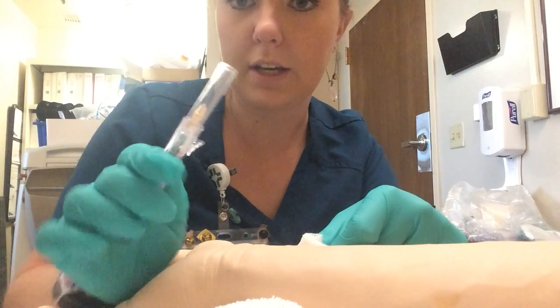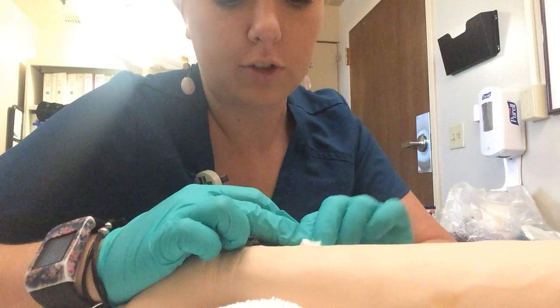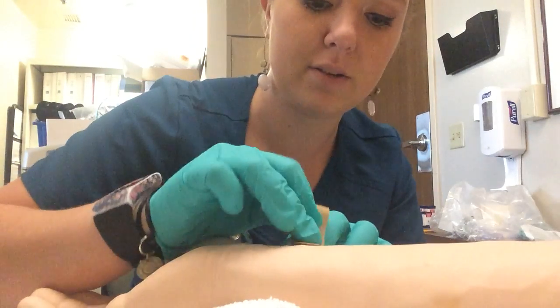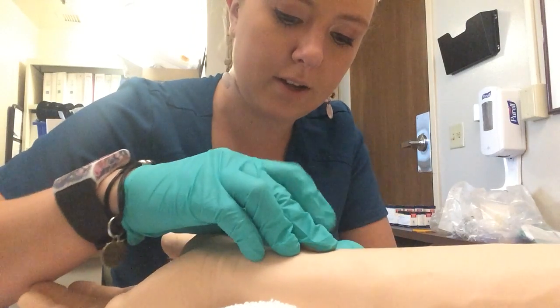Slide the safety cap on my syringe and set that aside. I hold pressure to this. After I've held pressure for the appropriate amount of time, I can take my band-aid, which I had already prepared, and place that on the patient.